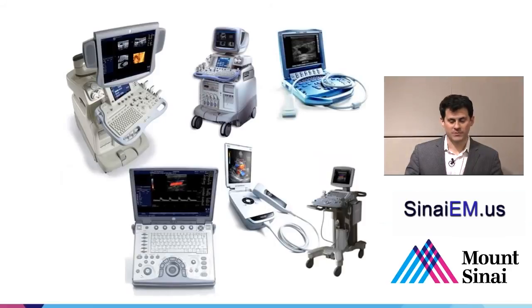Not so with ultrasound machines. Every manufacturer has different buttons. Every manufacturer has a different keyboard layout and different bells and whistles, some of which are hidden very deeply in the user interface on the machine, some of which jump right out at you. So any ultrasound machine that you're going to use, you have to know which buttons to look for.